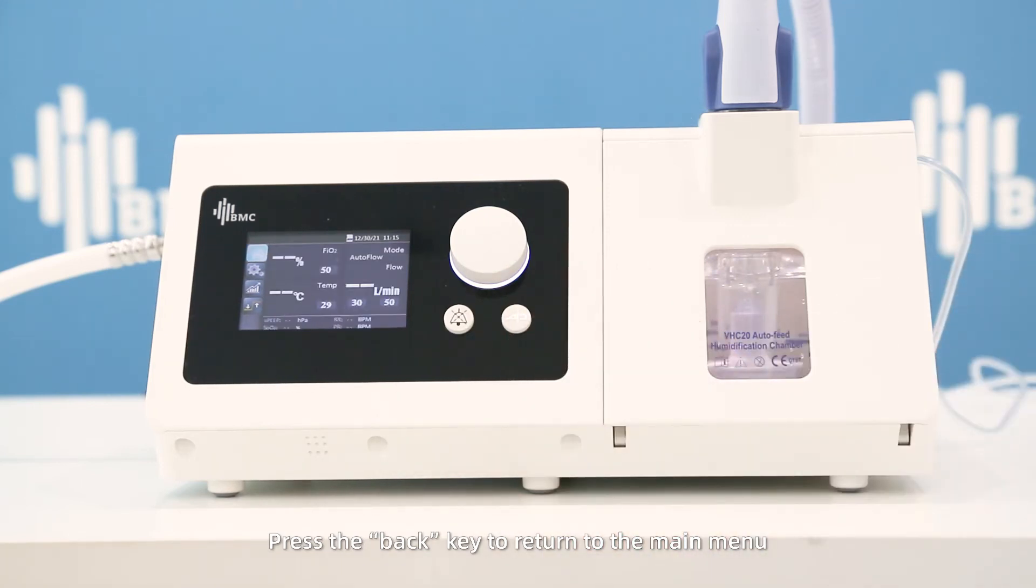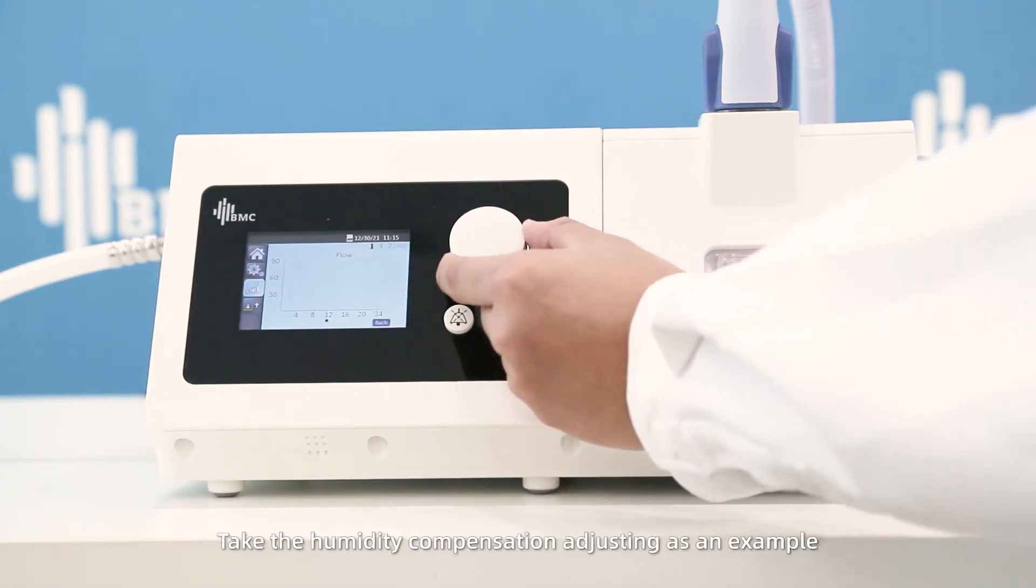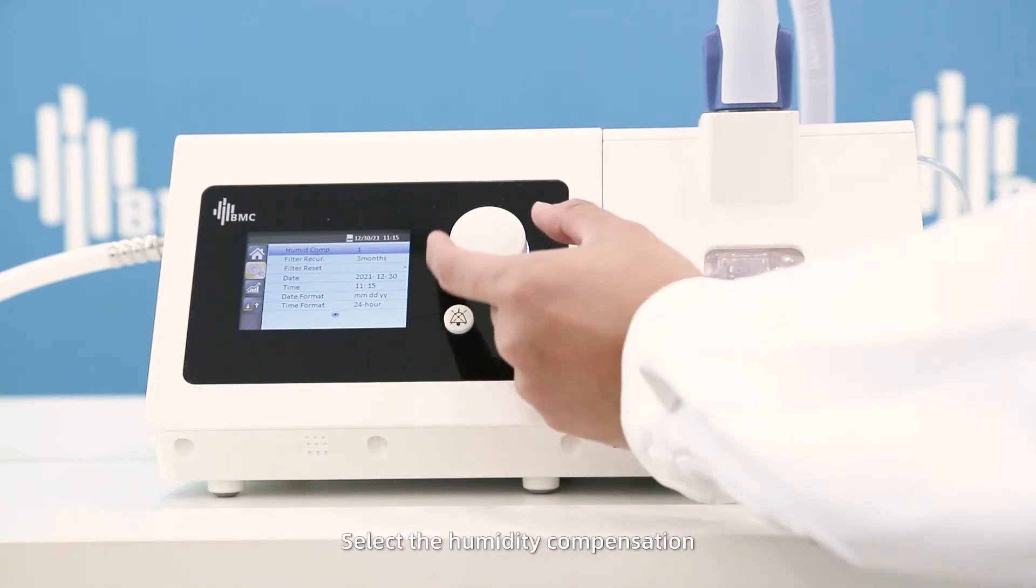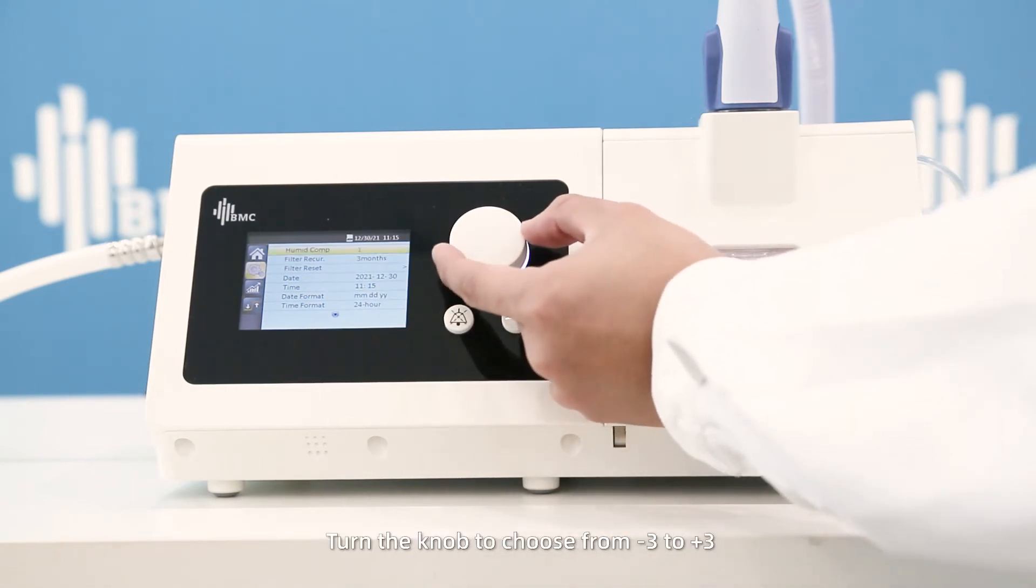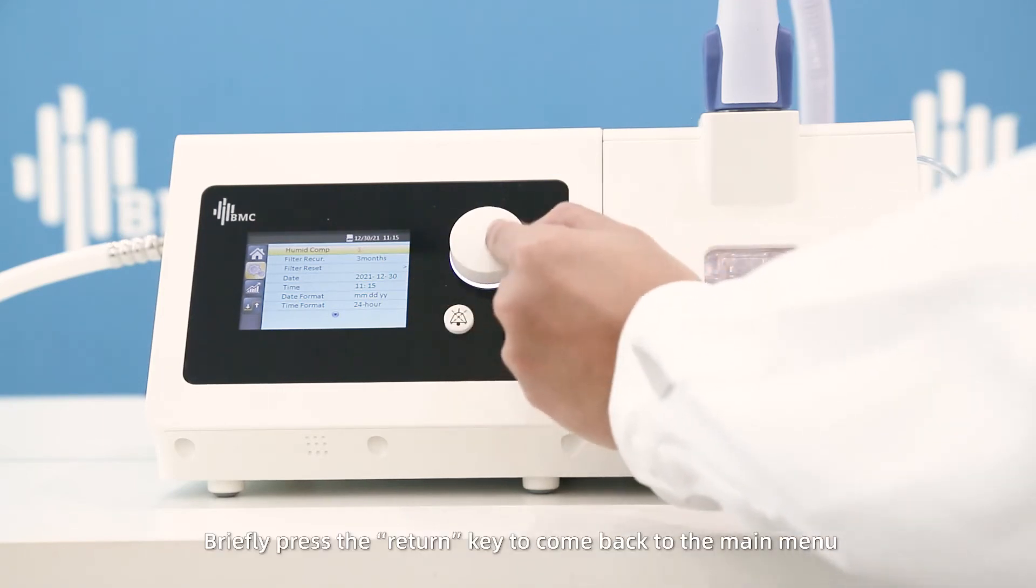Rotate the knob to select the setting interface. Take the humidity compensation adjusting as an example. Select the humidity compensation, turn the knob to choose from -3 to +3, and briefly press the return key to come back to the main menu.